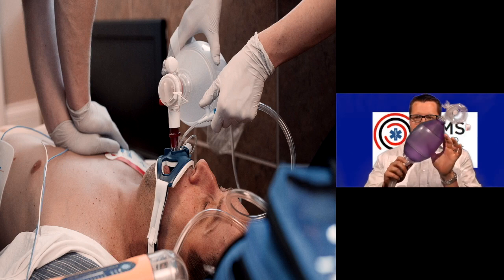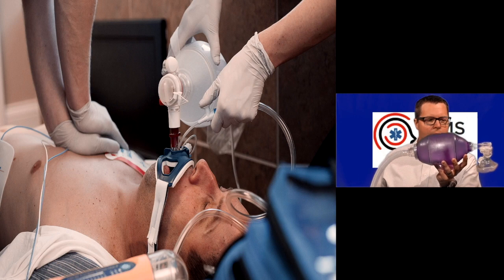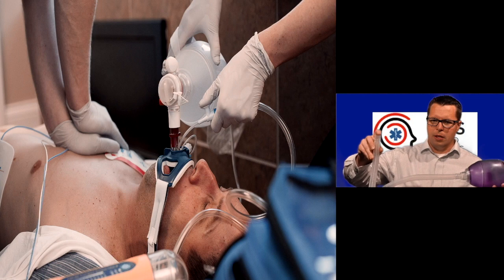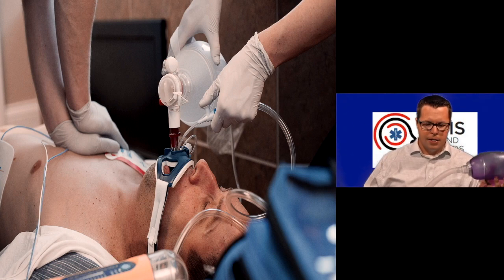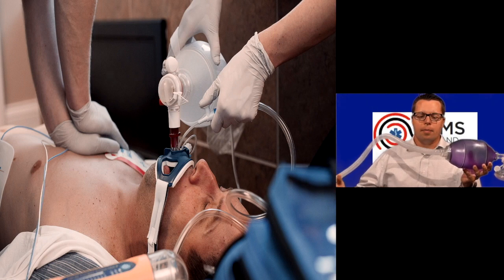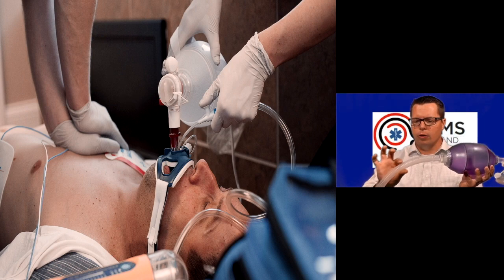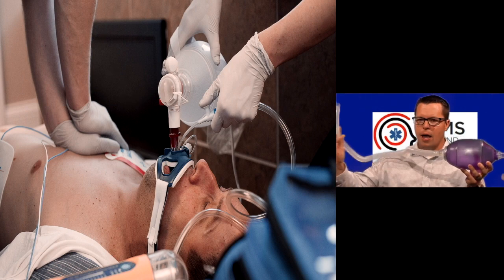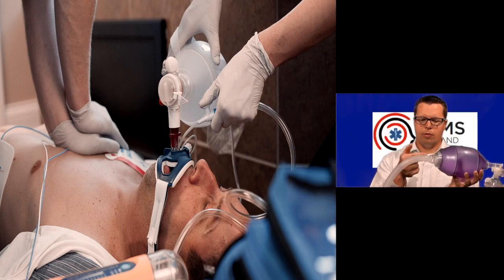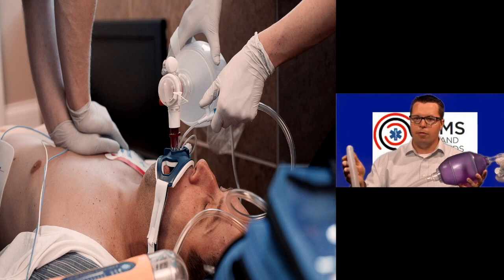Worth mentioning real quick, if you have this style of bag, or if you're accustomed to this, same basic mechanics. The difference is you may wonder what this thing is on the back, that the oxygen tubing seems to enter here and run through. This actually replaces the reservoir bag that was on that other thing. So what happens here is that oxygen comes down to yonder and then backfills through this tube here, and this is your actual oxygen reservoir. So the bag draws from this rather than from the jet of oxygen that's being delivered here. It draws from this filled up tube.